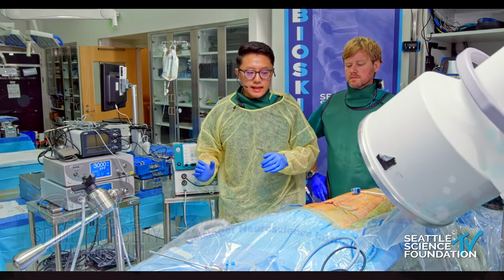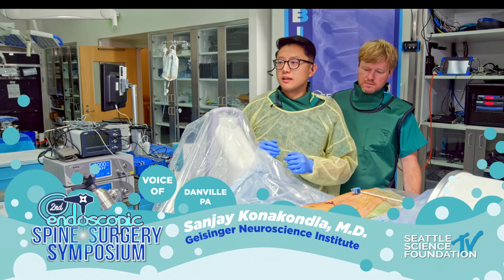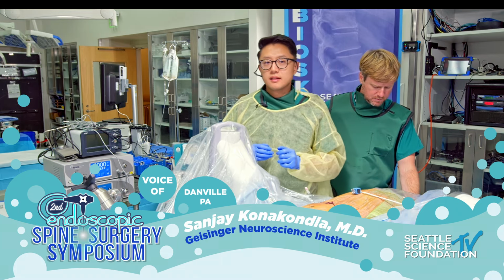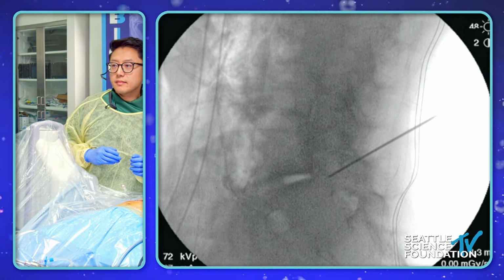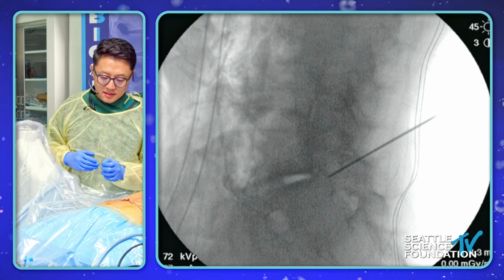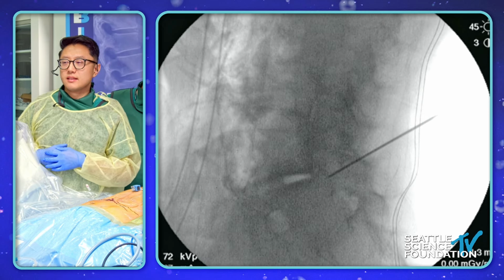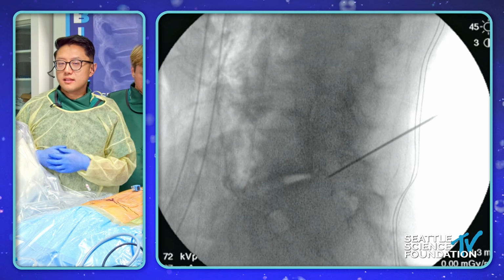Meng, can you hear me? Yes. It's Sanjay. I think it's important to know what you did there. Someone asked a question about redefining failure, and we had a good conversation about it yesterday during the question time. But what Christoph suggested of changing that incision, that's okay. You have a small sub-centimeter incision. If this is your first case, and first of all, it shouldn't be, with the spine. But if you're having issues getting to where you want to be based on your initial incision, make another one, right?